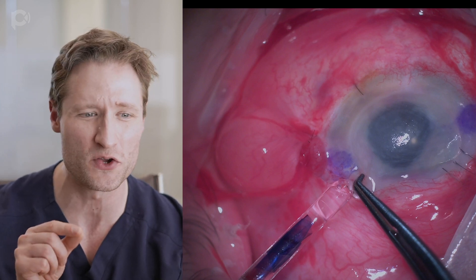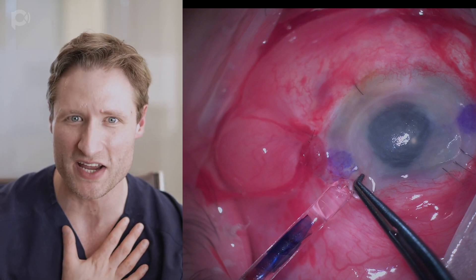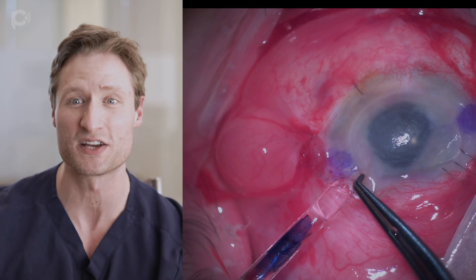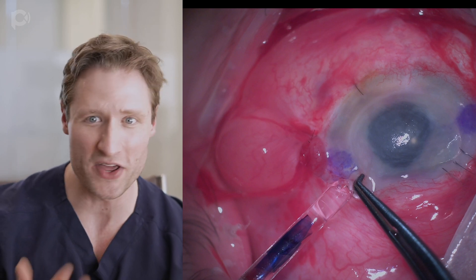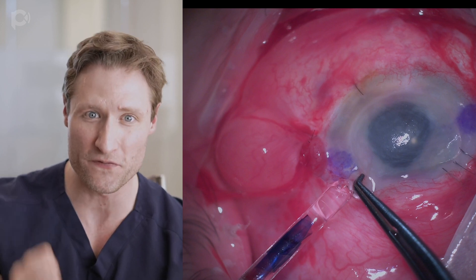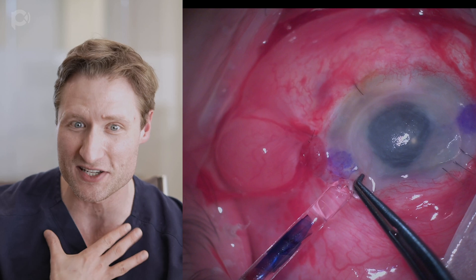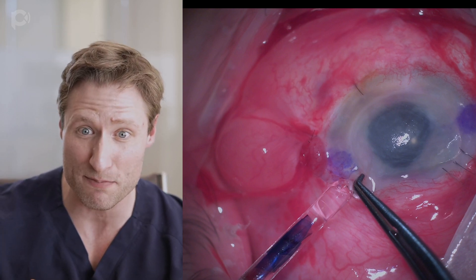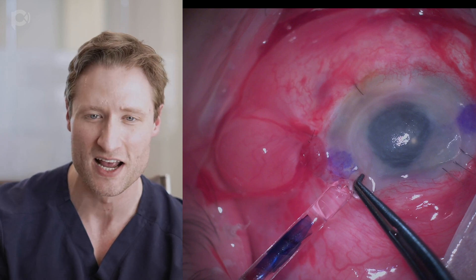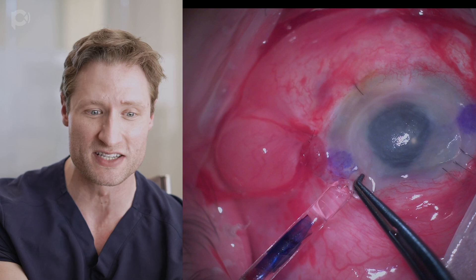I put a few stitches in my previous main wound off to my right. The reason is that I'm preferentially a left-handed surgeon, and I know this is going to be a complicated graft unfolding process because the eye is hypotonic. With hypotony, nothing acts right — your normal manipulations aren't transmitted down into the eye as they should be, and the great fear is losing the graft into the back of the eye. So I want to unfold the graft as adeptly as possible, placing my main wound where my dominant hand sits.